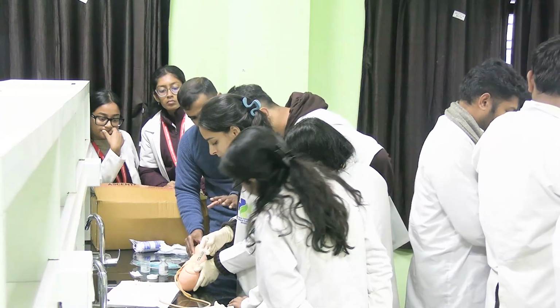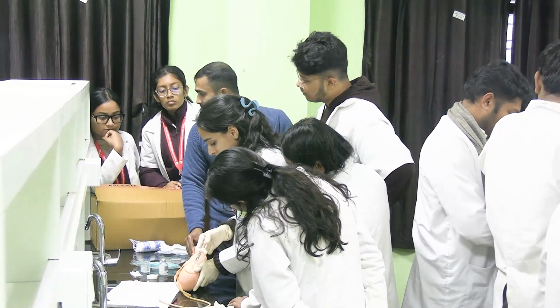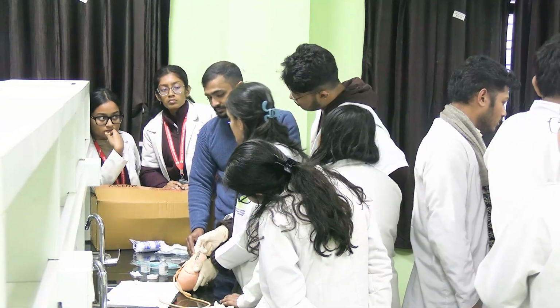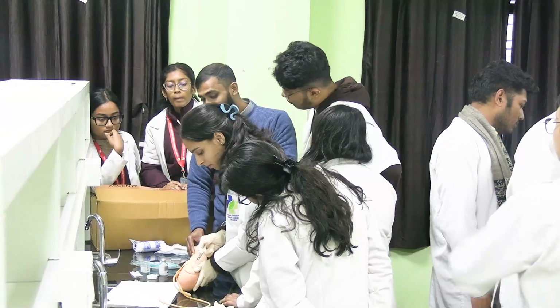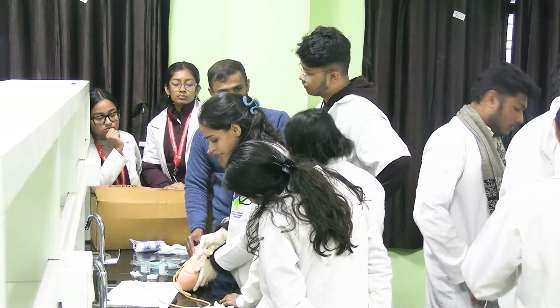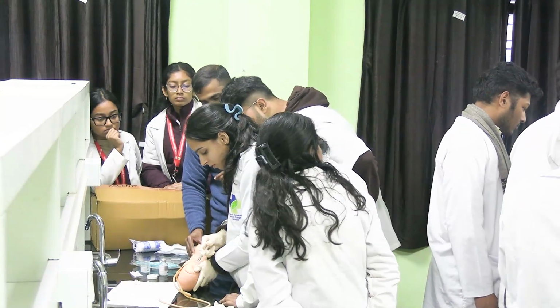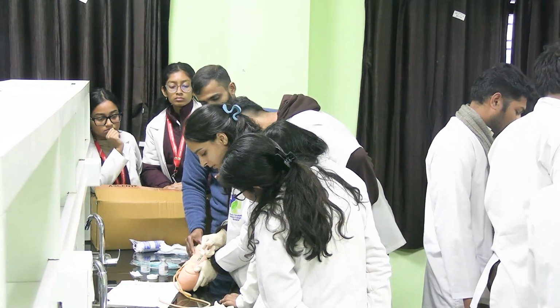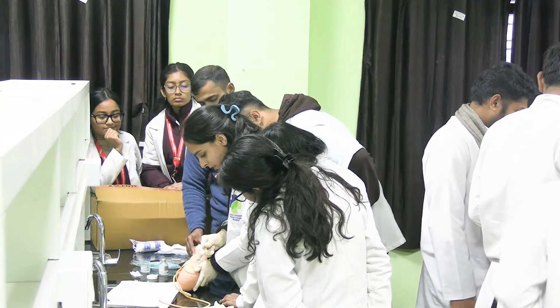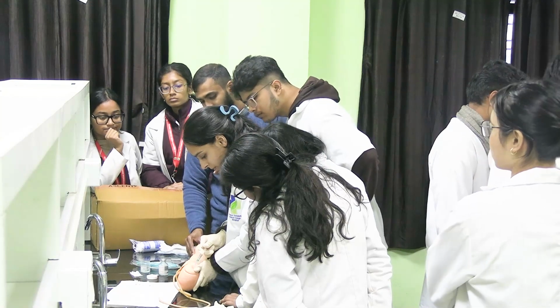So what should be the force and how much time will it take here? The insertion has to be fast, but the introduction of the drug should be slow. Around 30 seconds to 2 minutes. Go slowly, introduce it. It will go. Go slowly, 30 seconds to 2 minutes.